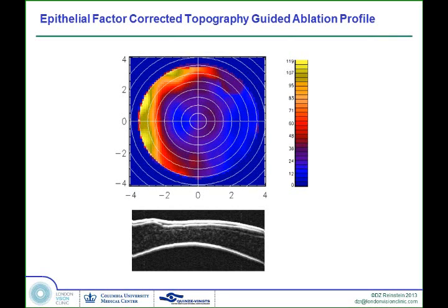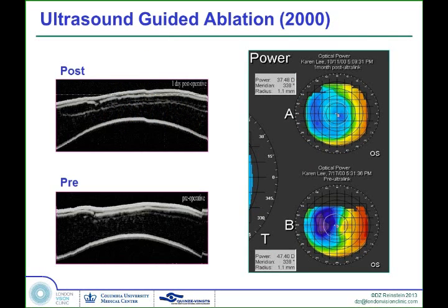of the topographer. Okay? So we did this treatment, and I created a second flap underneath. It's very easy to make a thick flap in those days. You just use your Moria, and then you get a big thick flap. I don't know how smart that was of me, but I did it. I got away with it. The residual stromal thickness was okay.